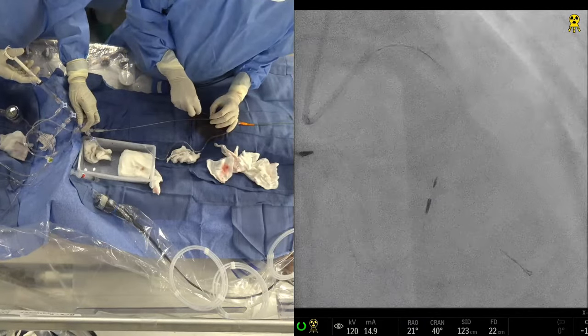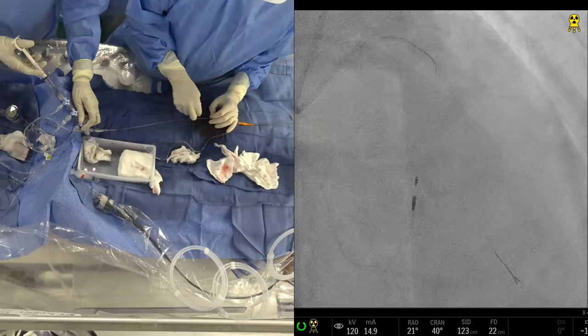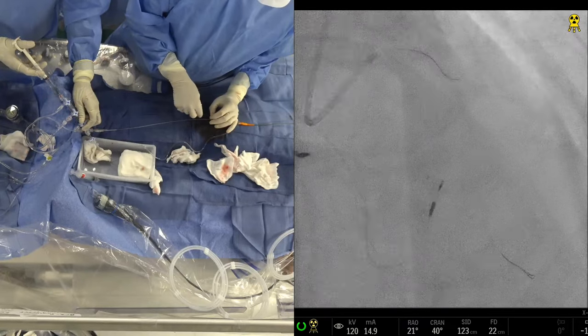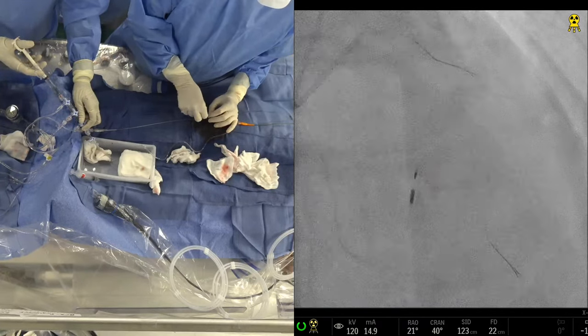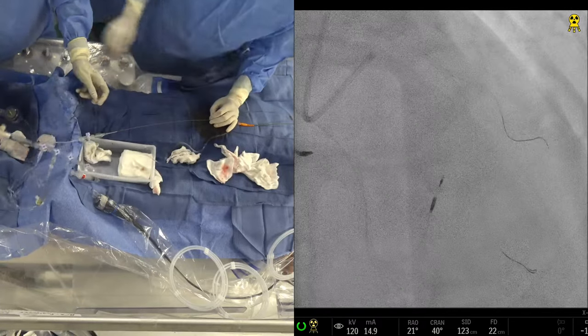In the DK crush, you want to go to the proximal cell. I think there are a lot of theoretical aspects to those, but they are not done in vivo, only in vitro. Okay, good. So you get your same 1.5 balloon again?